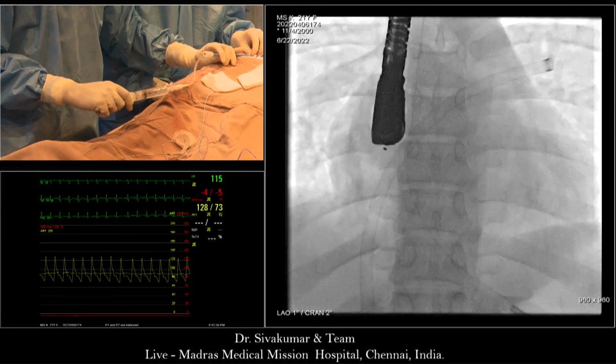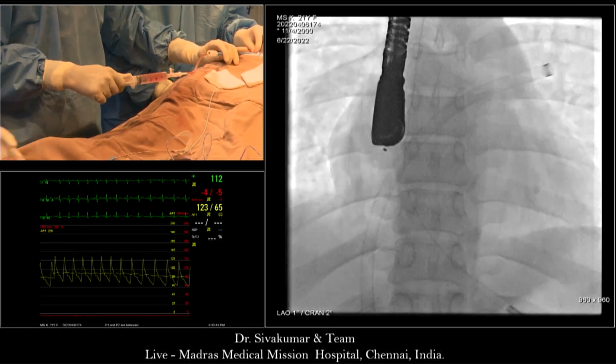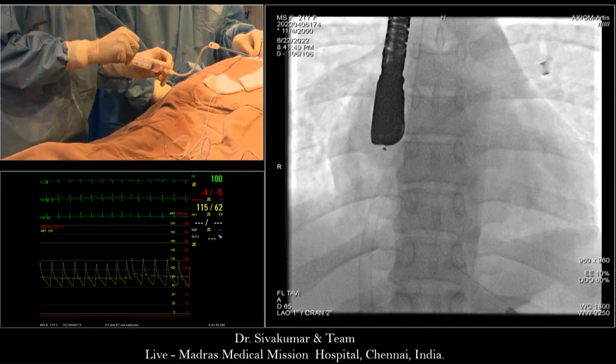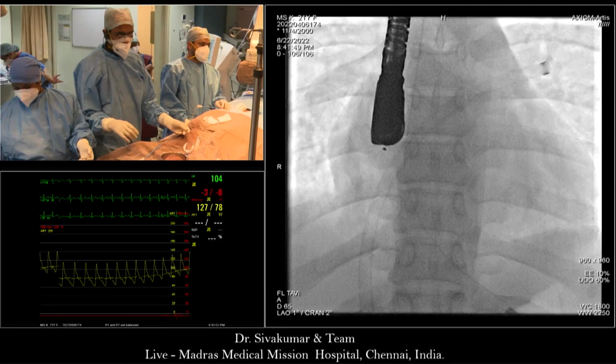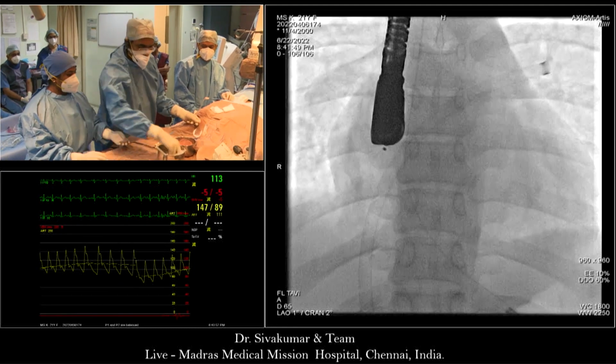This is very educational, Shiva. Really well done so far. Kudos to Nick. Nick, you're the man. So in support of Bharat's comment, I think the measurement of waist gives more information.